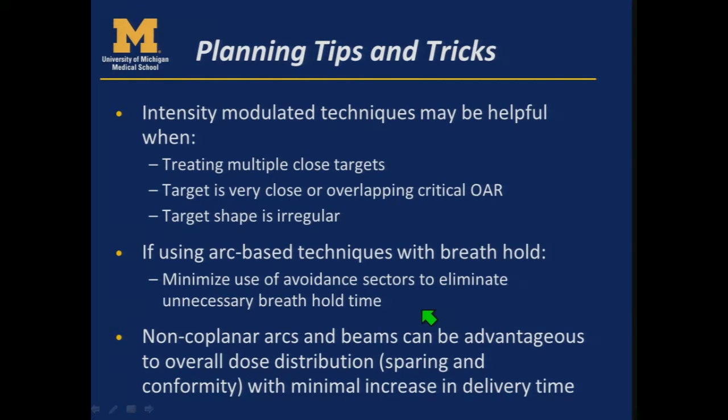Other tips and tricks: IMRT can be very helpful if you're treating multiple targets close together, if the target is really close to or overlapping a critical OAR, or when the target shape is irregular. If you are using an arc-based technique with a breath hold, be sure to minimize the use of avoidance sectors in your VMAT planning, because it can cause the patient to hold their breath when you're not treating, since the therapist can't necessarily tell when that beam is going to turn back on. It's better just to have no motion at that point in the delivery.